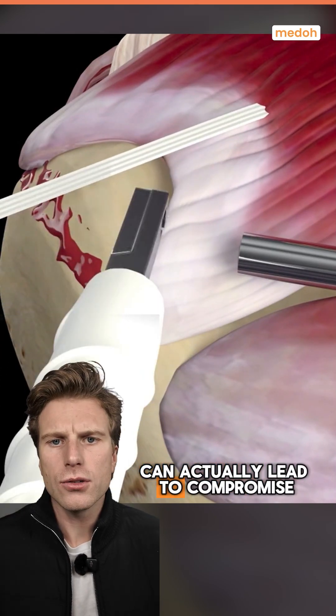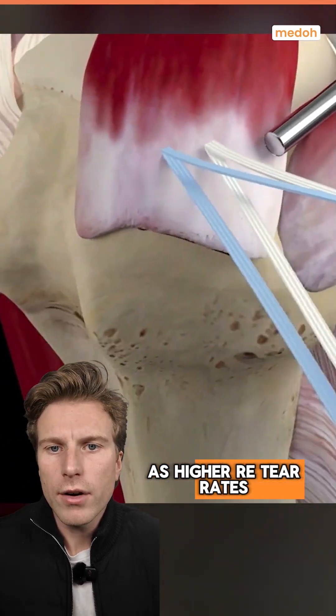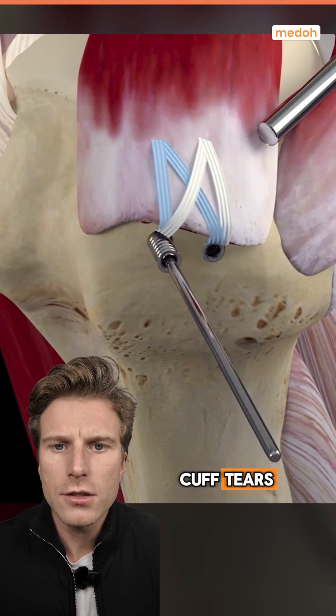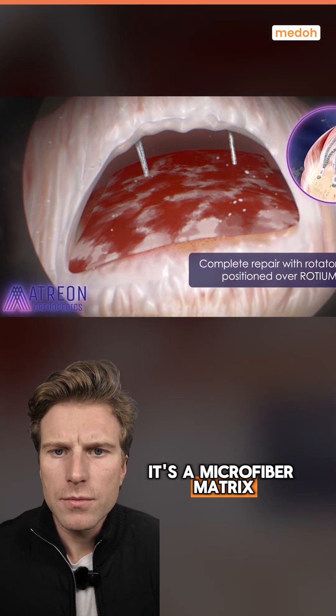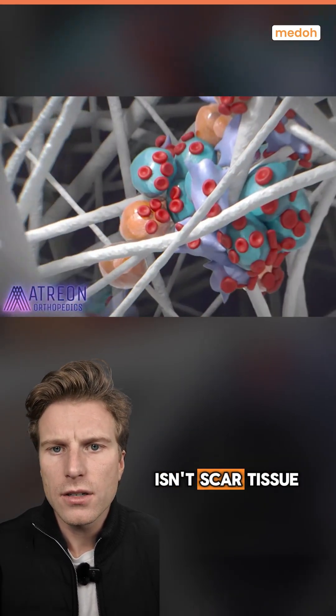This type of healing can actually lead to compromised long-term outcomes, such as higher re-tear rates, which can be up to 35% in rotator cuff tears. But Rotium was designed specifically for this — it's a microfiber matrix that helps the enthesis create new tissue that isn't scar tissue.